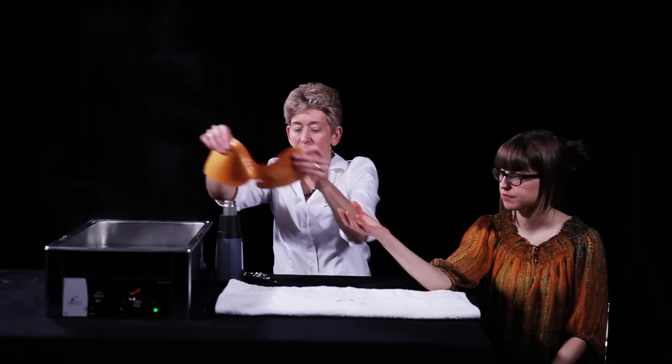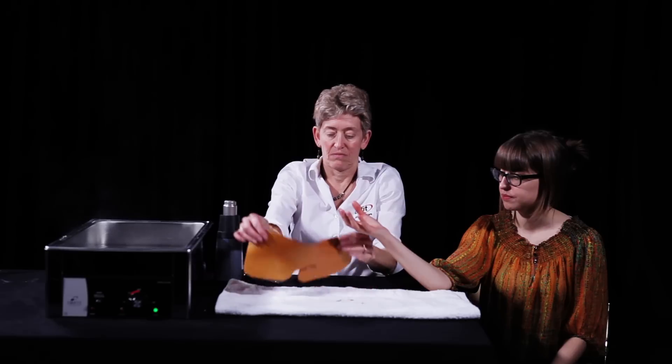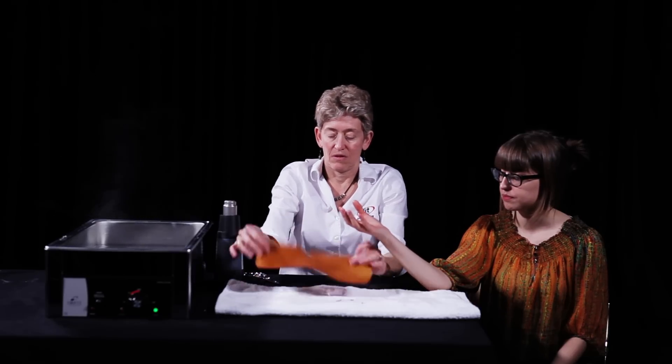Remove the heated orthosis from the water bath with two hands and dry briefly on a towel to remove excess hot water.